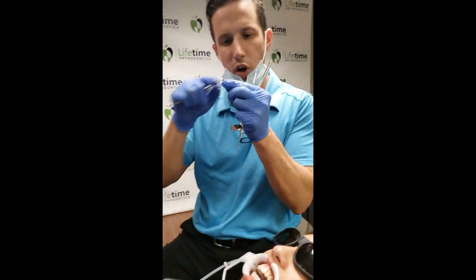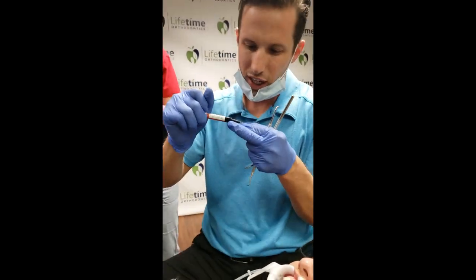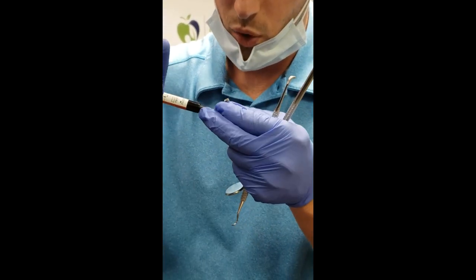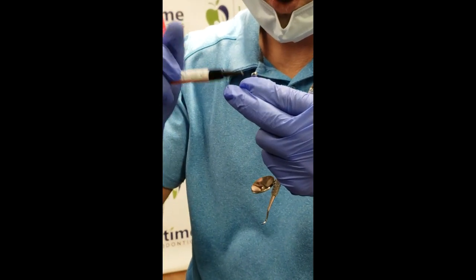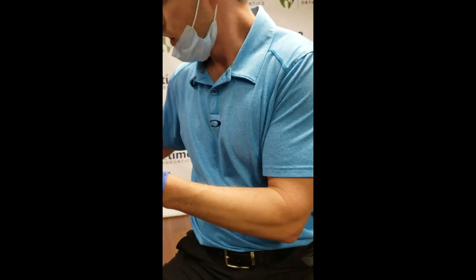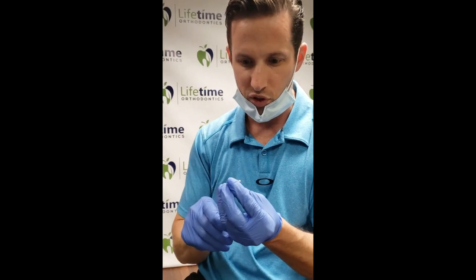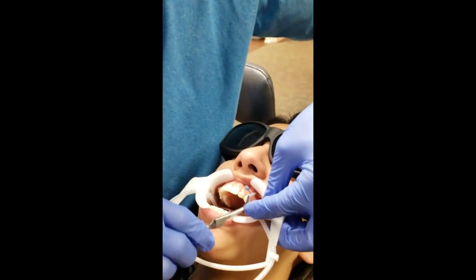This looks good - it's all buttered into the bracket. I'm going to add a little bit extra. Like I said, these appliances are ones where I like to add a little bit more than I normally would for a bracket or an attachment. For most brackets and for attachments, and for this one too, a little bit extra is preferred.